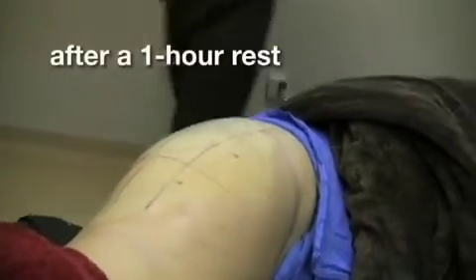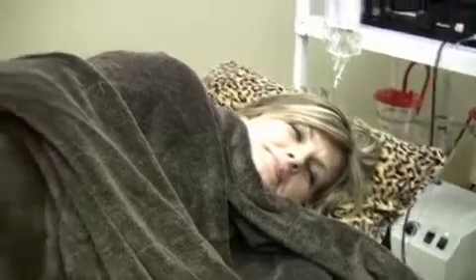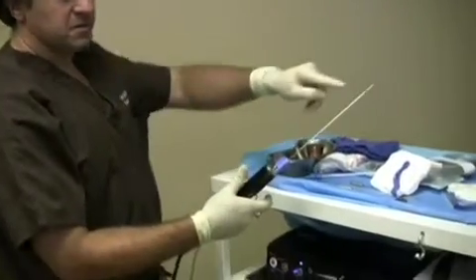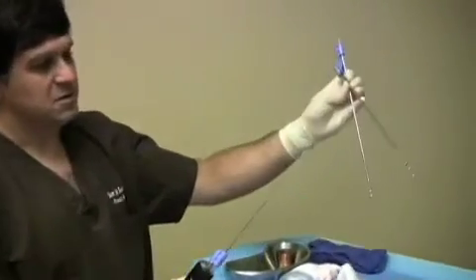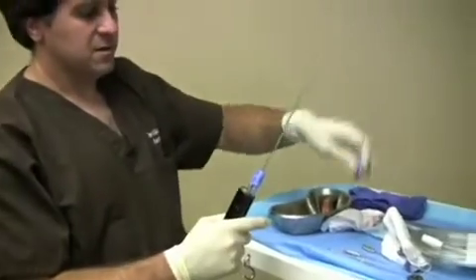We've allowed her to rest for about an hour. The swelling's gone down. She's intensely sleepy, and that's, I think, usually from the high doses of the lidocaine. So now we're going to start the extraction phase where we start to do the liposuction. This is the power-assisted liposuction device made by Micro-Air. This is a 3mm cannula, which is fairly small. There are some bigger ones that I will sometimes use, but even these are a little too big. And then there are some finer ones, like this.